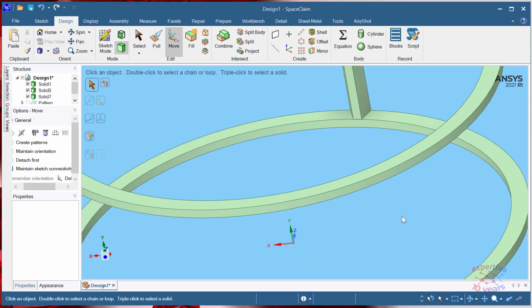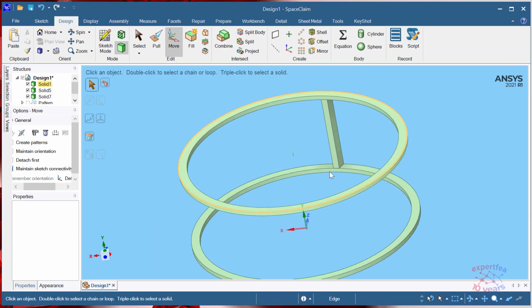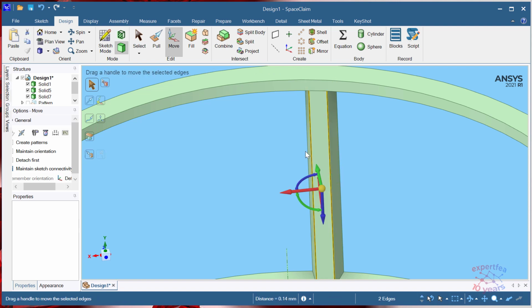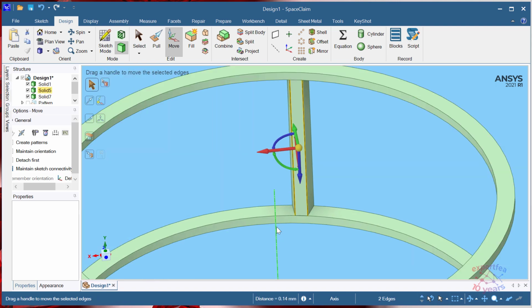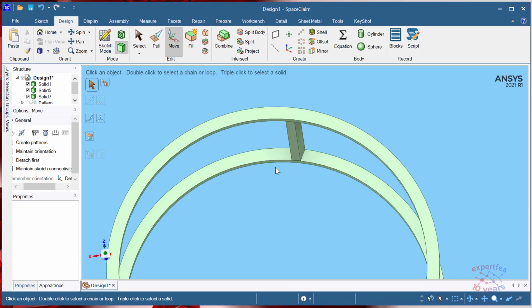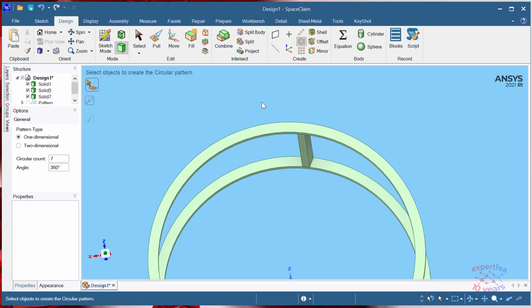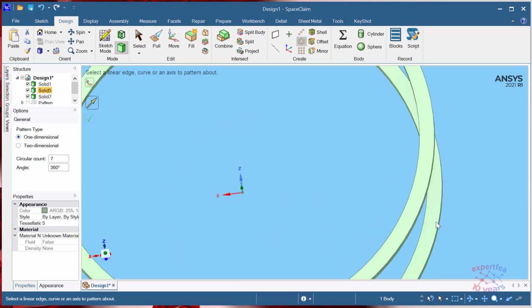3.9, yeah, why not? And this, let's change again the reference and 1 degree. Let's verify the thickness now. 0.14, yeah, it's acceptable now. And let's pattern this strut, yes. So create a select objects to pattern, axis.